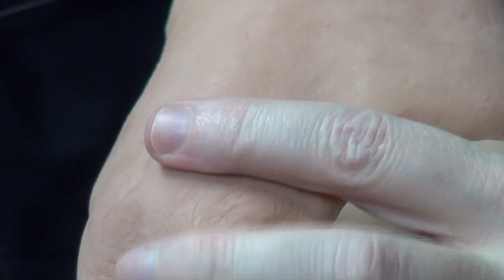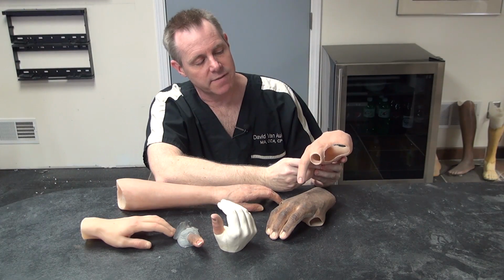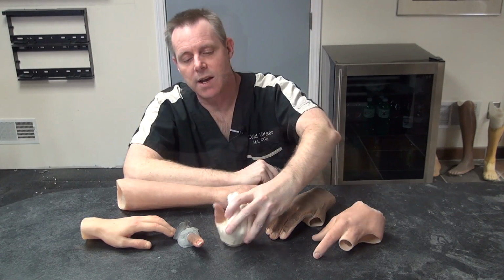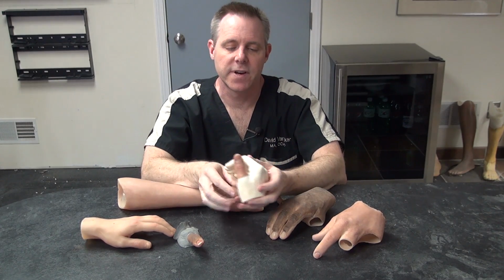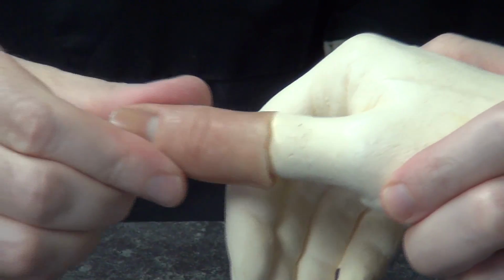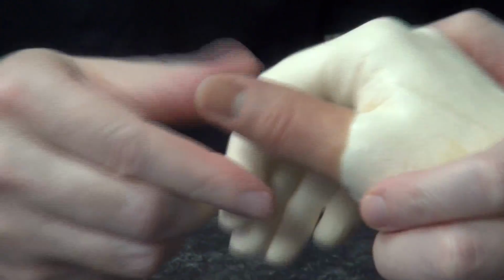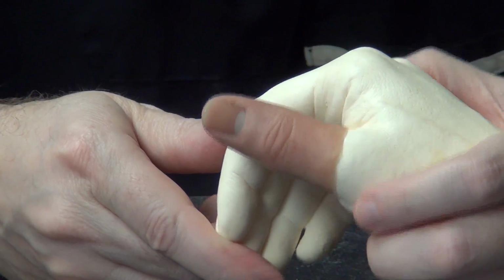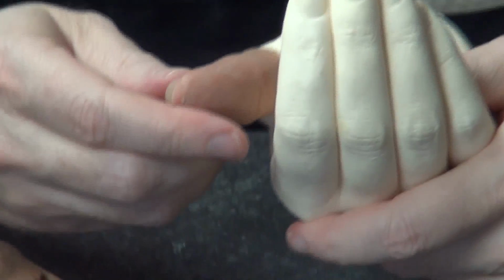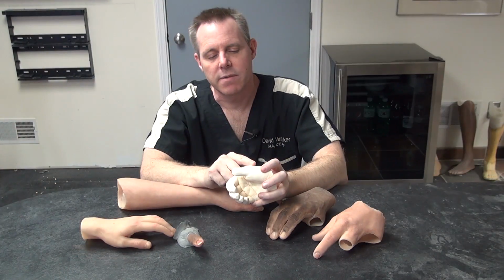Now this is another unusual shape for a partial hand, so that what you see for fingers is what was missing, so we recreate this. Now in this case, we were able to use a life cast successfully to create a higher degree of realism. With a finger prosthesis or digital prosthesis, that's our fancy word for fingers in the medical realm. There's an example of a thumb prosthesis. Now the thumb itself is either one of the more successful or least successful of hand restorations.